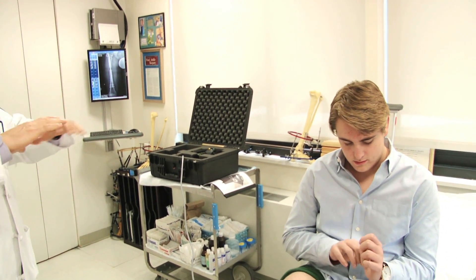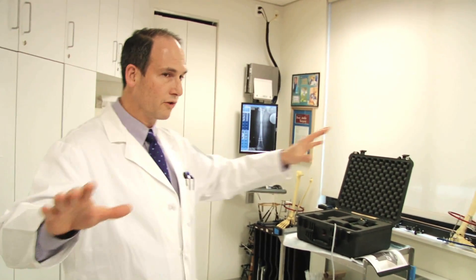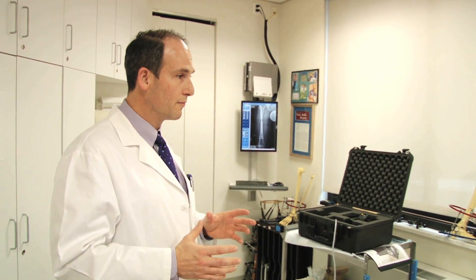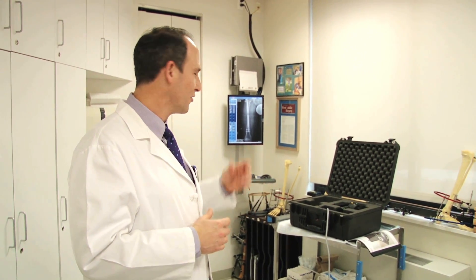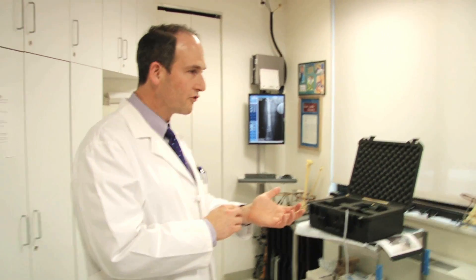I think it's really important to create a metal-free safety zone about two feet in all directions. You need to find a particular spot in the house where you do your treatments and do it in that same spot every time. You don't want to do this in the kitchen, and you don't want to leave the magnet sitting on the kitchen table. You should get rid of watches.